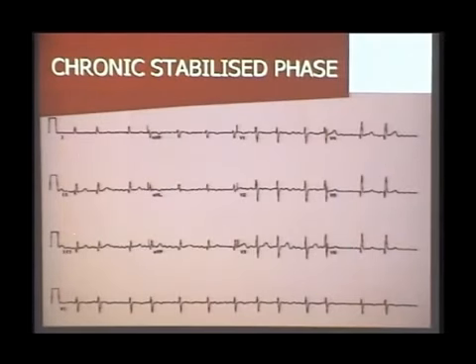You can see it in this ECG, in the inferior leads. Single sentence diagnosis, quick. Chronic stabilized phase, okay. Chronic total occlusion of RCA. You can see that the pathological Q wave is there, the ST is normal and the T wave is normal. So this is what happens. There is no injury, there is no ischemia. Only the necrosis remains, the scar remains. So here your job is to prevent the next myocardial infarction.